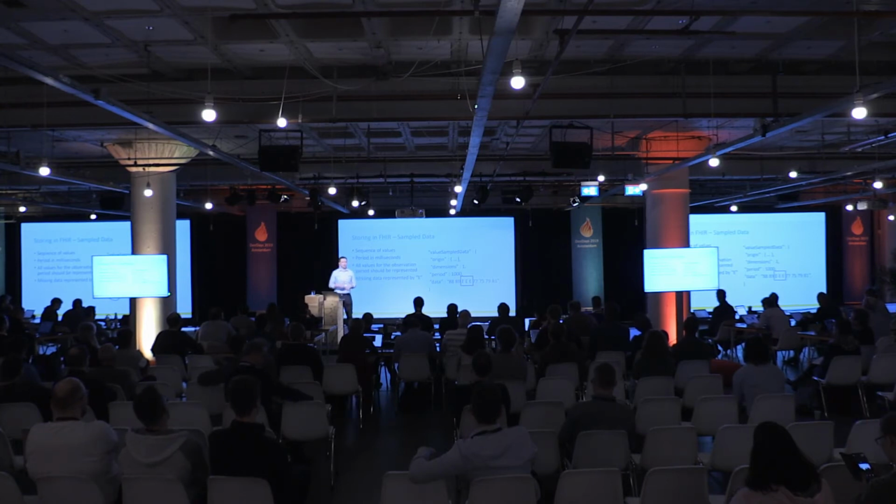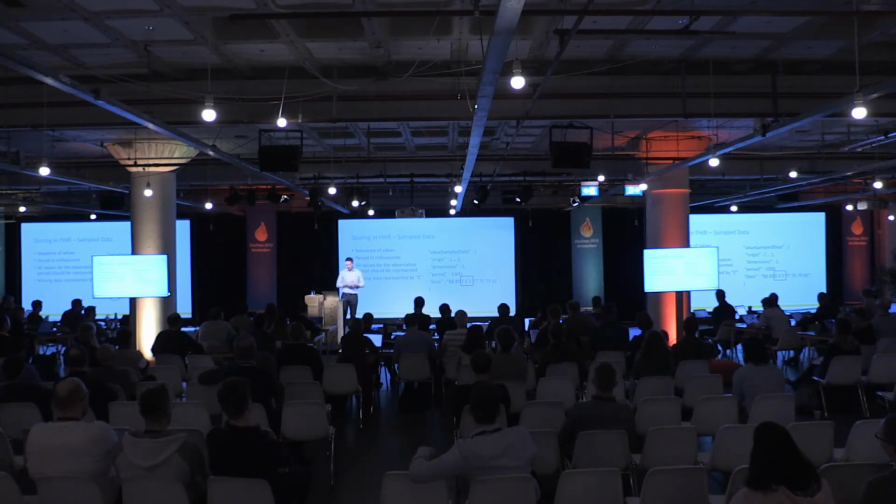There's a couple other components about this data type, like you can support multiple dimensions and things like that. We're not using those in our current implementation, so any of the examples we see today will have a dimension of 1. But yeah, so this is how you would show a large period of data.